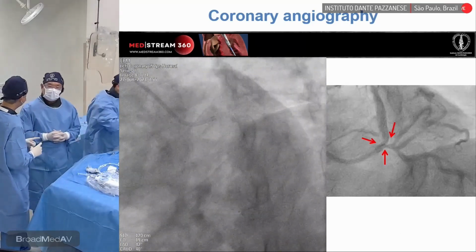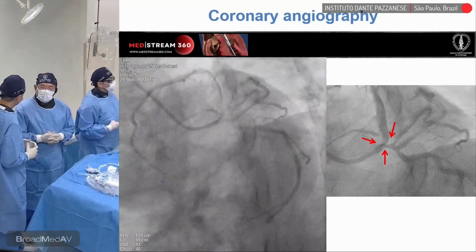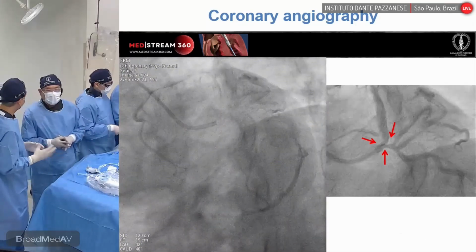So in a case like this, is it applicable to consider physiology or imaging, or do you already feel confident enough to say, no, I have to treat this, and I'll first target what I think is the worst lesion?